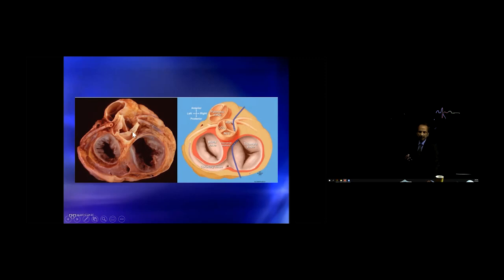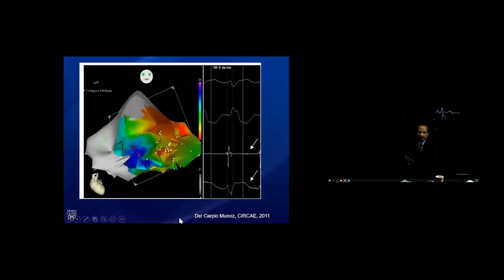The non-coronary sinus and the right sinus of Valsalva are not single points, they are some distance apart. So you have to do further mapping in that area. But even then you might be helped by which was a little earlier. Was it the His A? Was it the CS A? Was it the left-sided A? Even if it's only a few milliseconds, it may give you a clue which way to go to get to that side. Really nice.